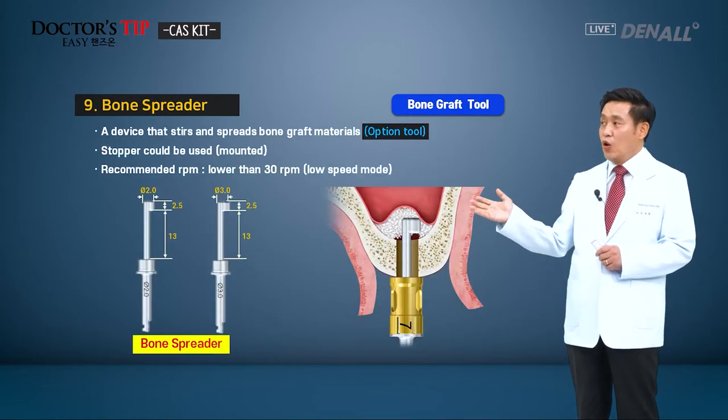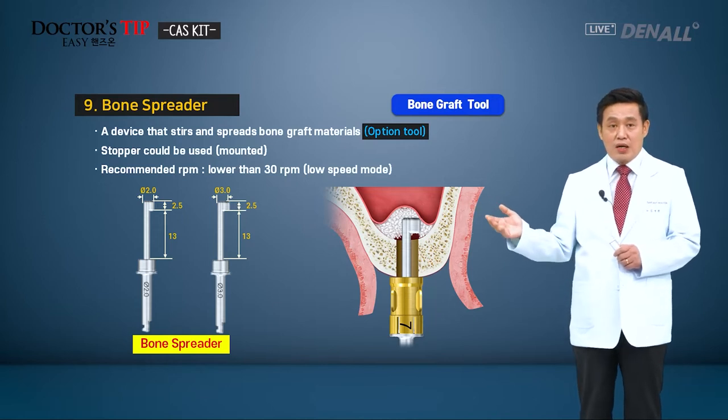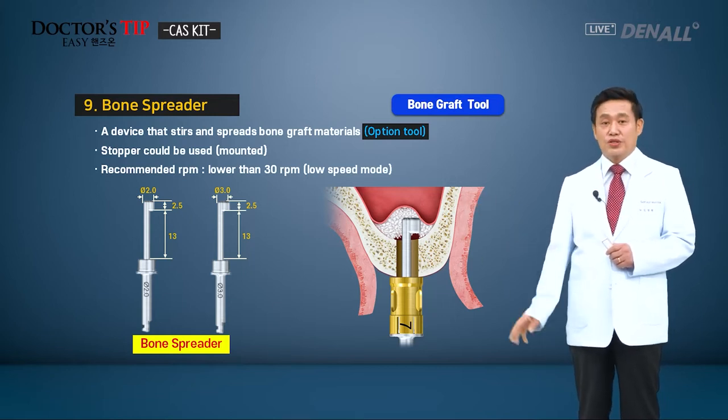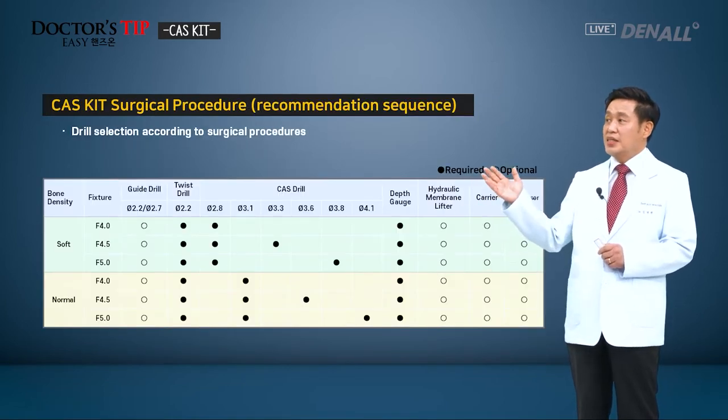Next, bone spreader. This is an optional tool. When you do the implant placement, the graft material is blocked and stops being pushed in. Then the bone spreader can be used to spread the blocked bone material.